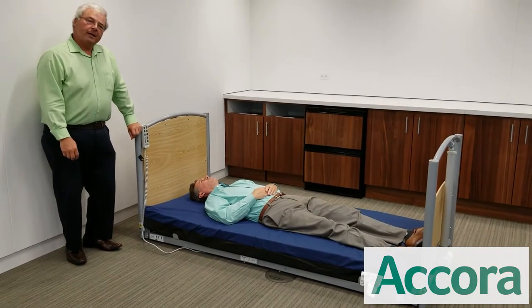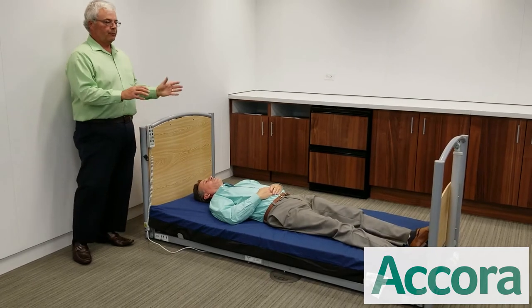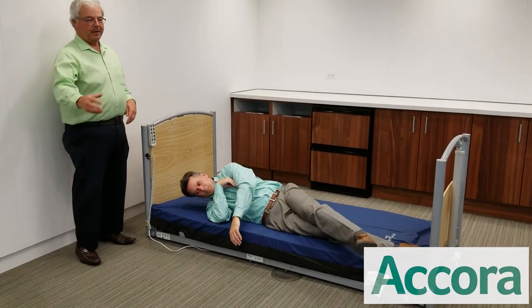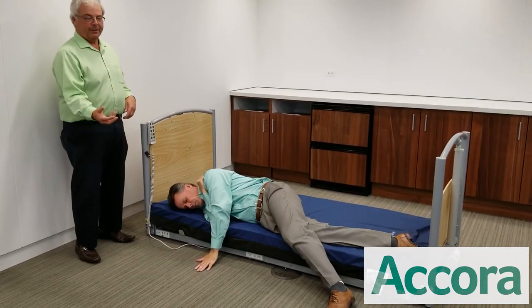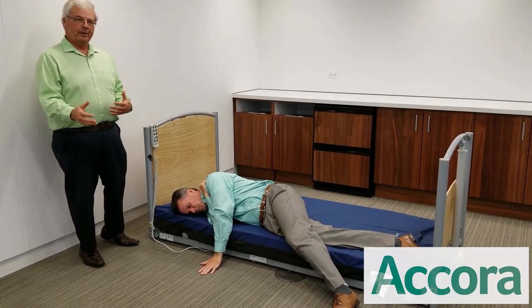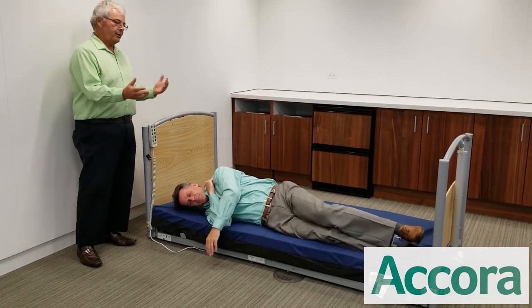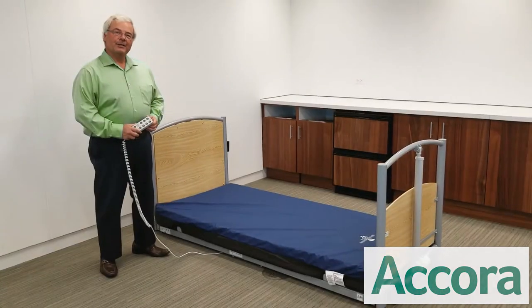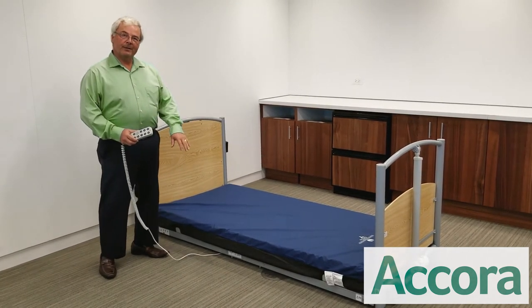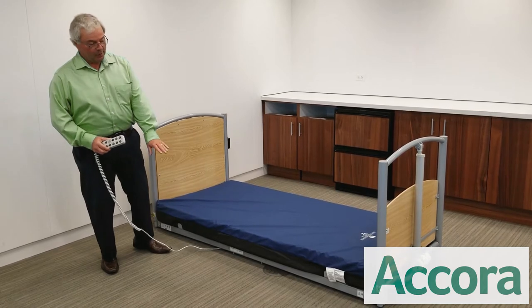What we've found in practice from facilities that have started using the floor bed is that when a patient starts to roll out of bed, the first part of their body that hits the floor is their foot or their hand. When they feel that floor or our safety mat, they stop rolling and will actually roll back into the bed. Should the patient continue to roll out, the risk of injury is greatly decreased because the mattress is so close to the floor.